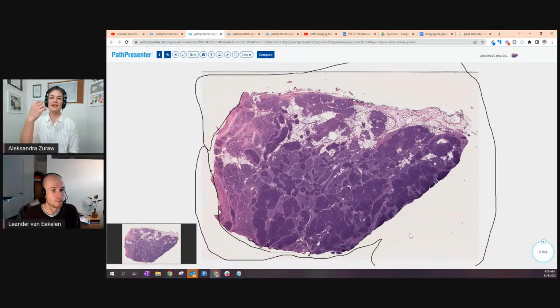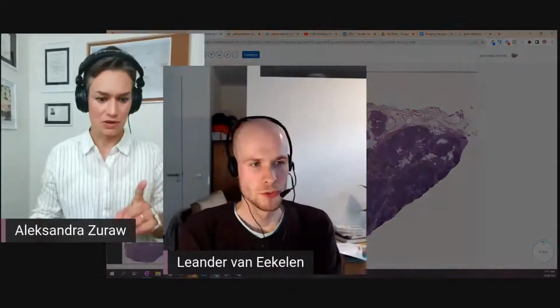And that brings me back again to this comparison, computer vision versus human vision. How do I perceive this image? I see everything at the same time, and I know the white is white. I don't care about this. Whereas the computer has to do it step by step, and I didn't even know that this was the way you had to translate it for the computer. I used to get really frustrated that one approach would not tackle all the other problems. And first of all, there were not all these approaches at the same time. Semantic segmentation was before instance segmentation, and now we have the panoptic. So yeah, let's keep talking about panoptic before we go to classification.